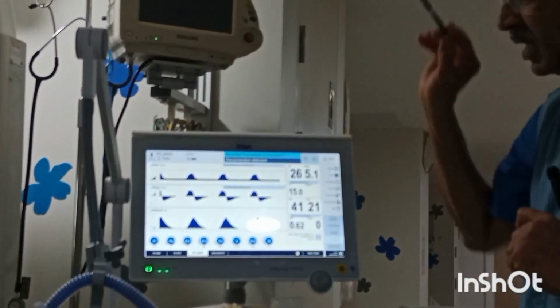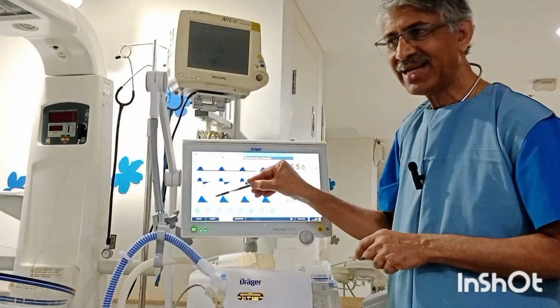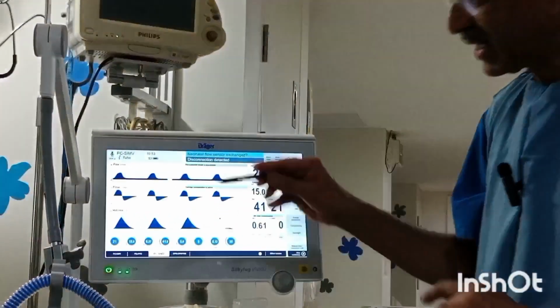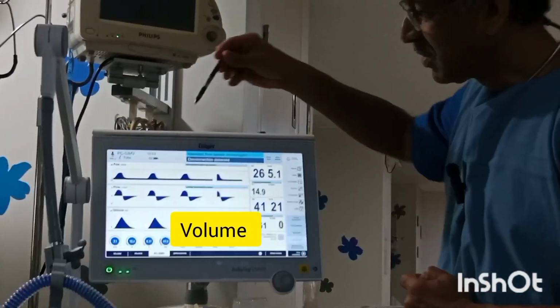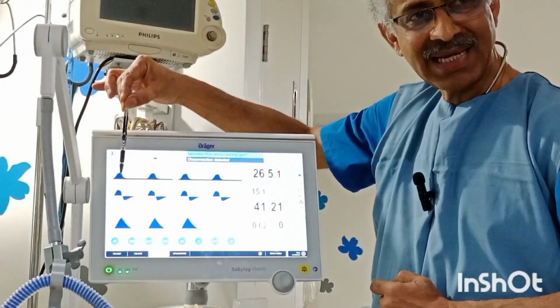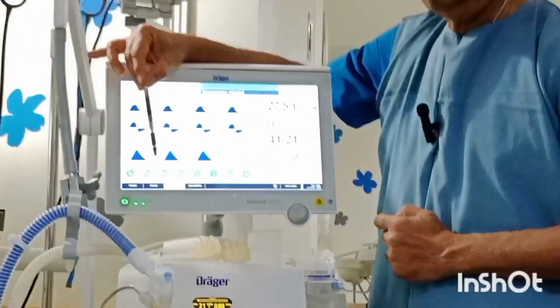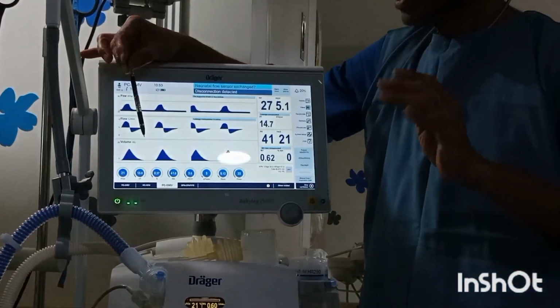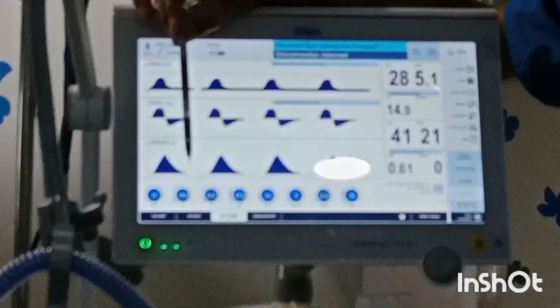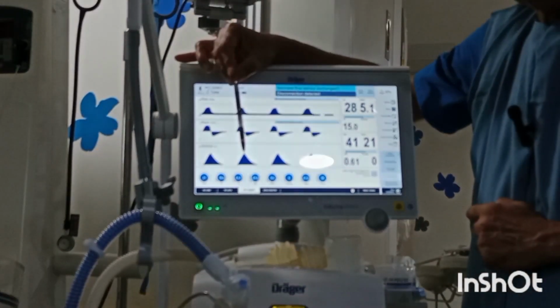Now, coming to the next, this is a 3-dimensional area where the air occupies the whole alveoli. So, that is your volume. You can see this and the pressure curve, they almost look the same, but what is the difference here? In this volume time curve, there is no peak. It starts at the baseline and again ends at the baseline only. So, this is the volume time curve. Okay.